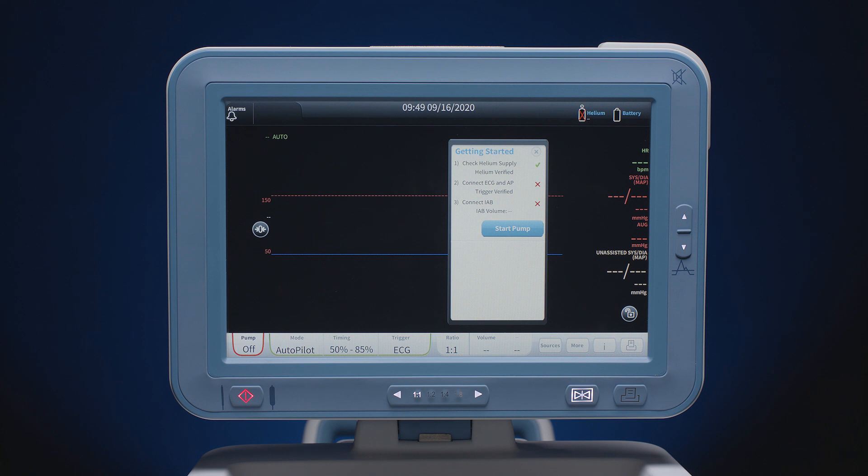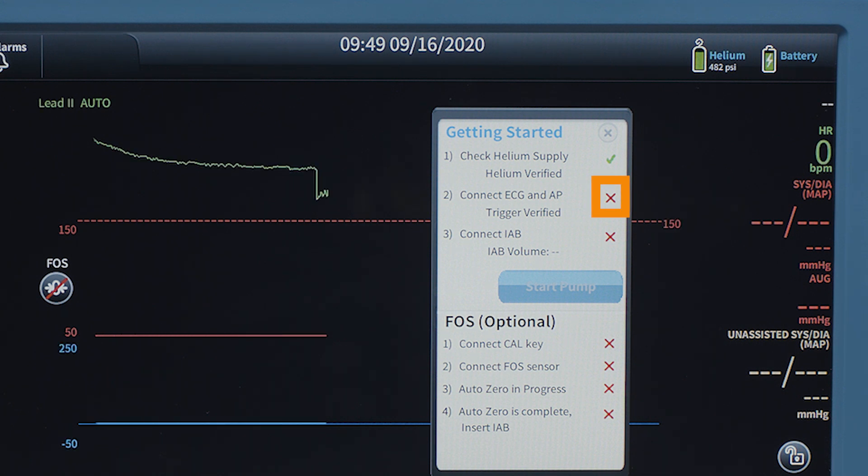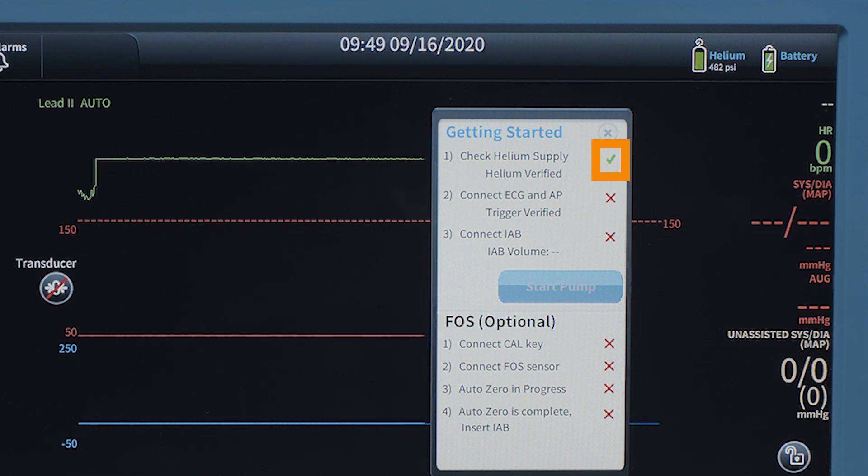When powering on the pump for the first time, the getting started checklist will display. A red X next to an item indicates that item is not ready and further action is needed. A green check indicates that an item is complete and no further action is needed.